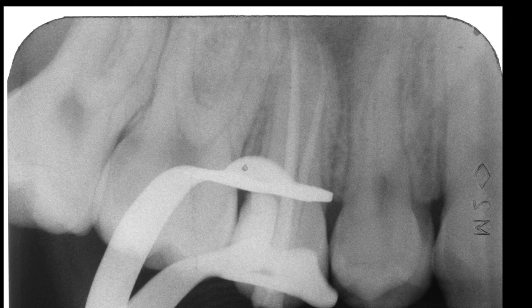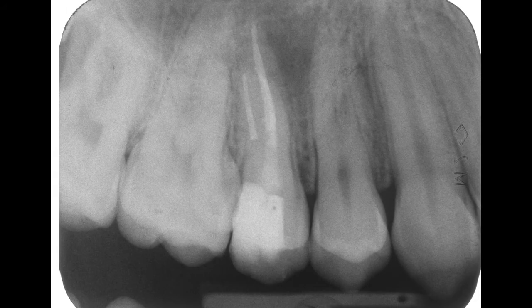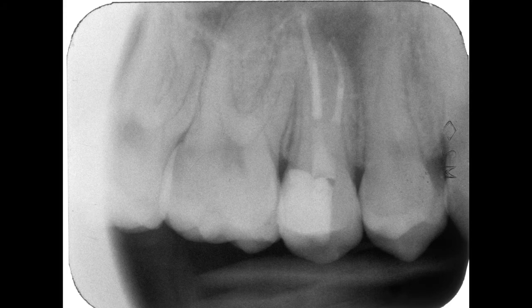Now the master point X-ray shows the situation after the preparation with ProTaper files. In this case, it was necessary to take two eccentric radiographs to show all the canals. Also, the final result after obturation. I think that was an interesting case, not only regarding the use of ultrasound. There is a small void in the final resin filling that was redone after I saw the X-ray.